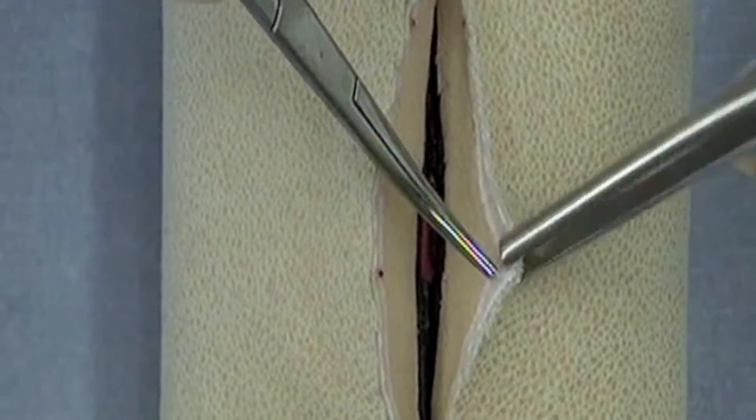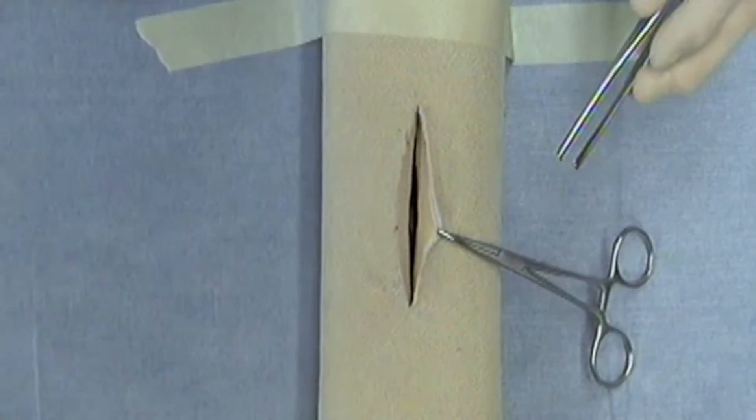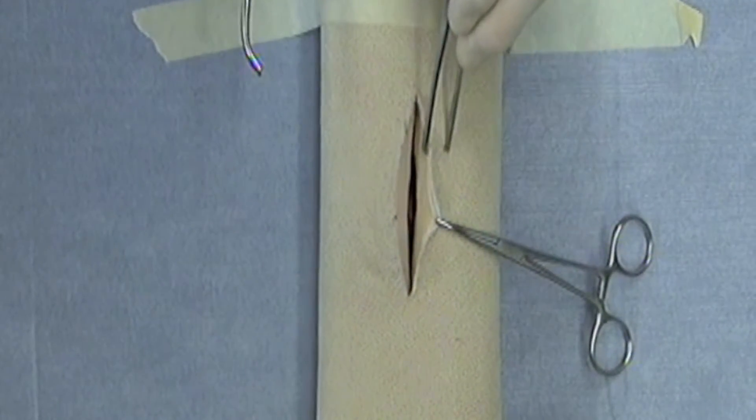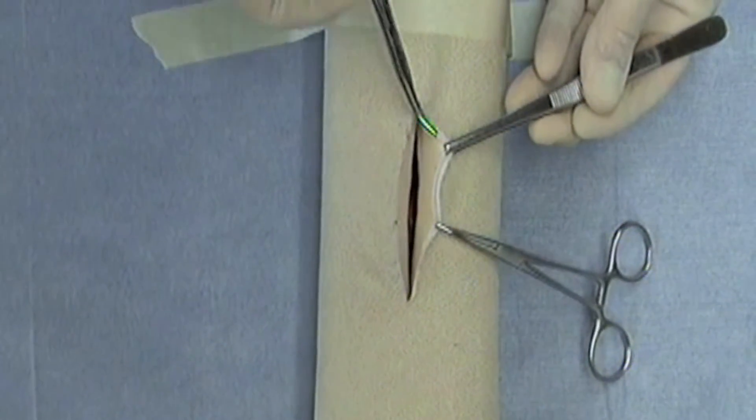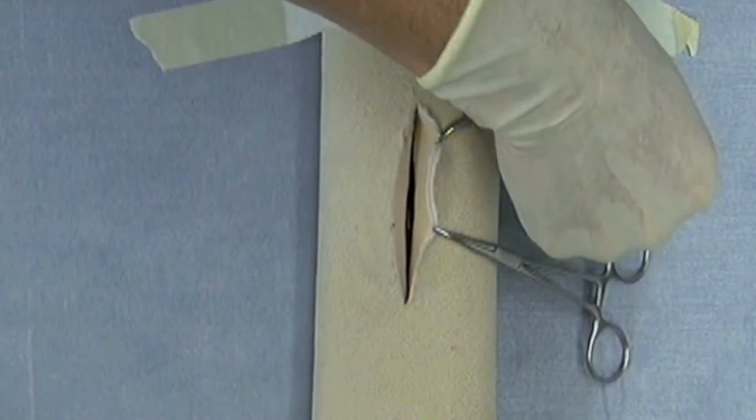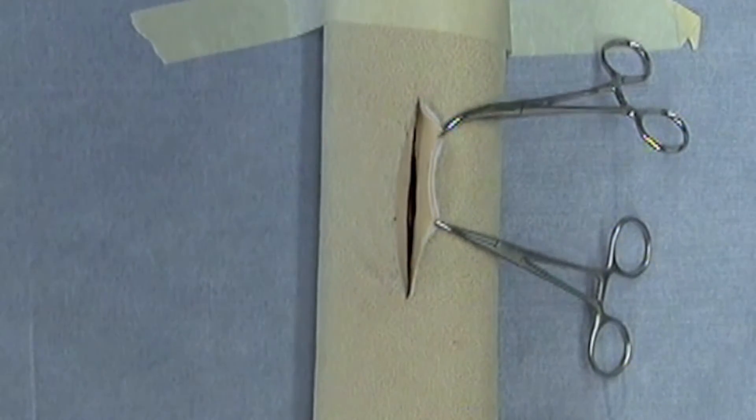Now I've successfully grasped the vessel in that manner and then I'm going to roll it over until I perform the ligation. Generally speaking, what you do after you make your incision is go ahead and clamp the vessels and then you're prepared to perform your ligation technique.